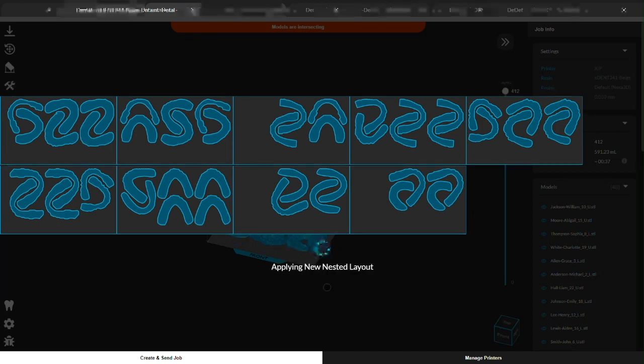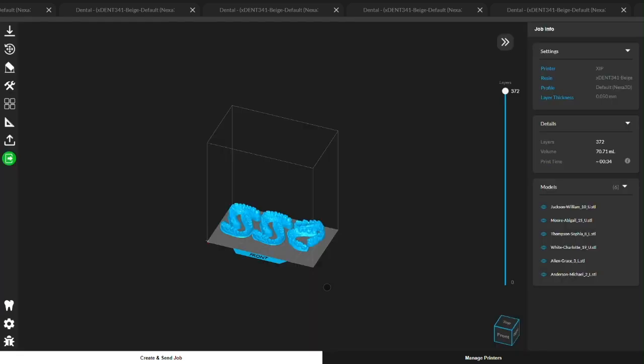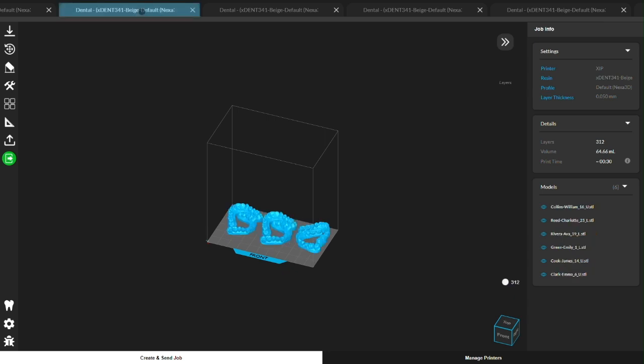This was just a quick overview so we made some edits for time, but you can expect the process to take about five minutes. That's five minutes to prepare an entire day's worth of prints. And now I can spend the first half hour of my day enjoying my morning coffee instead of clicking and dragging models around like most 3D printing build prep software.